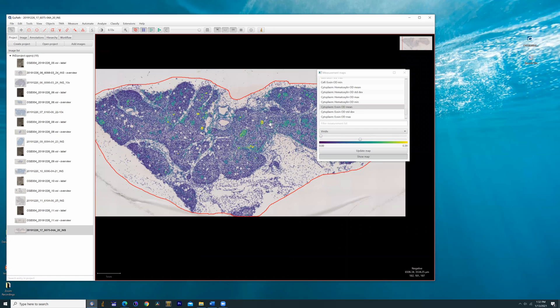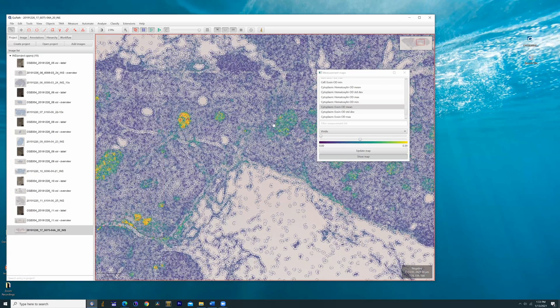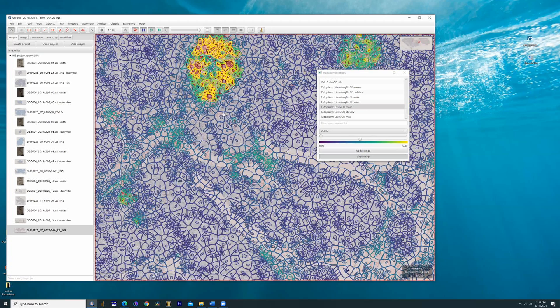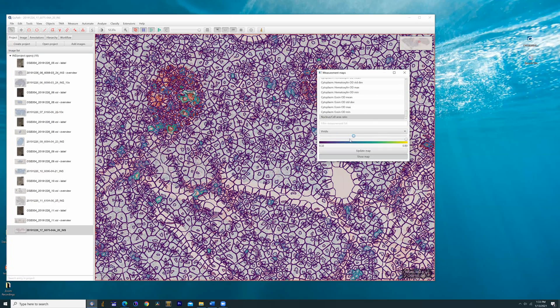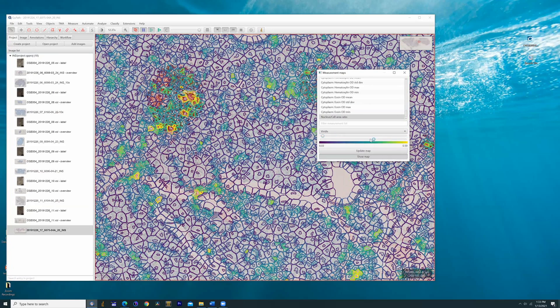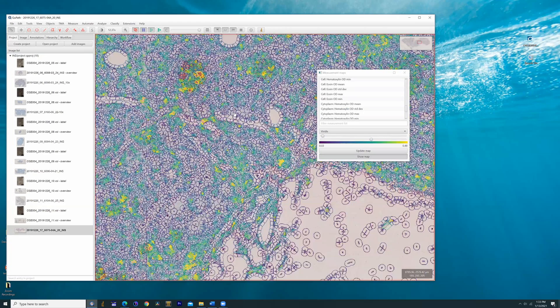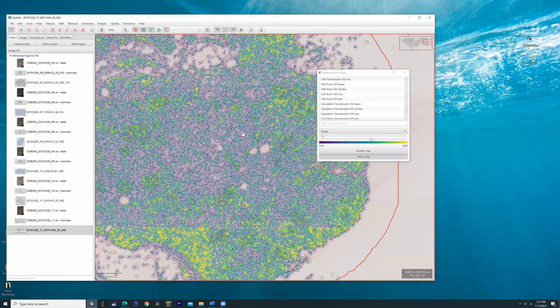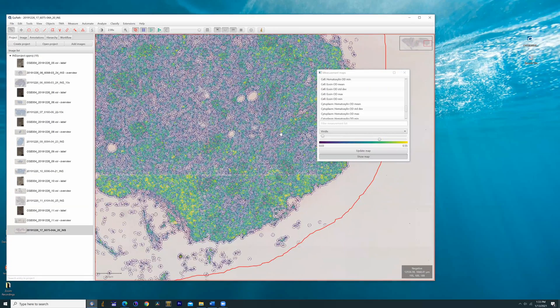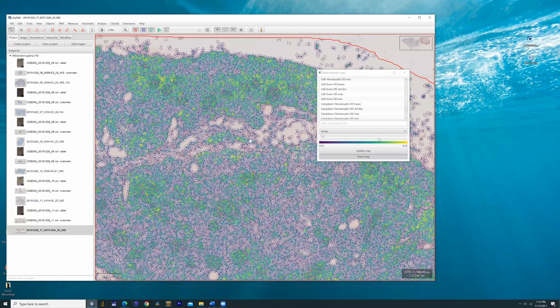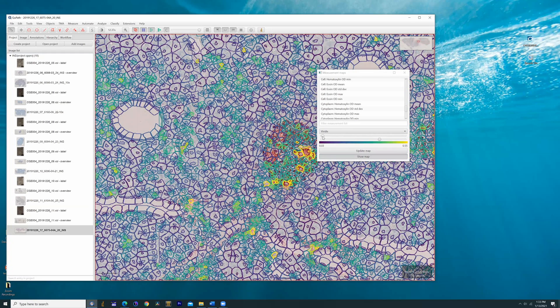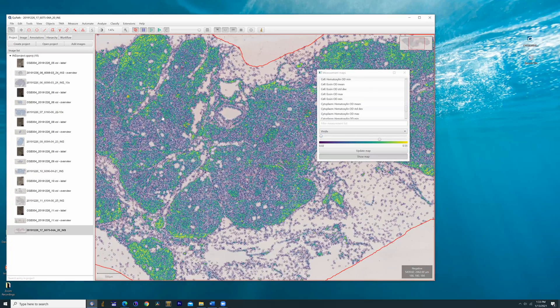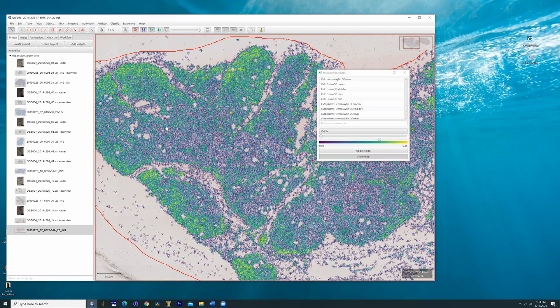And what's fun about this is if you want to see, you could theoretically map out, maybe there's a structural feature where there's more intense staining, or you could pick out something like the sectional area, the extroverted tissue tends to be larger. So you can, let's try nuclear cytoplasm. And so now you can look at relative size, cell size and nuclear cytoplasm to nucleus size or whatever as a reference. Anyway, you can imagine, you can highlight this in different ways and it makes for a nice presentation. So for example, in this case, it looks like these smaller cells are actually extended to the outer edges of the section, the larger extroverted tissue inside is stained dark. And in this case, it's not a lot interesting, I guess, but you can see how this might be more interesting. You look at different cell types through, say, gating on tumor cells or some other tissue where you've pre-gated your stain and label, and sort of a way of highlighting a global view of a tissue section.